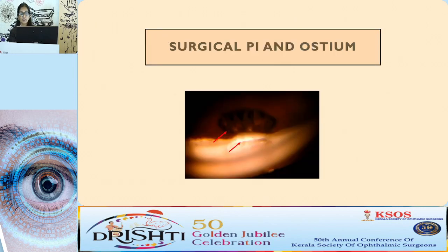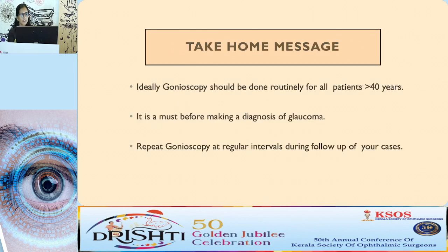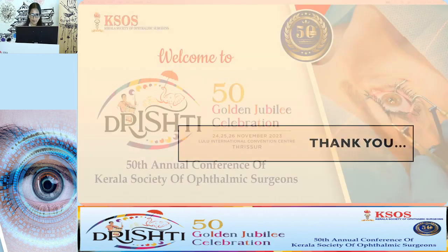Remember to check the patency of the ostium after trabeculectomy. Cleaning, usually we clean with soap and water. The take-home messages: in ideal conditions, gonioscopy should be done routinely for all patients above 40 years. It is a must before making a diagnosis of glaucoma, and repeat gonioscopy at regular intervals during follow-up of your cases. Thank you.